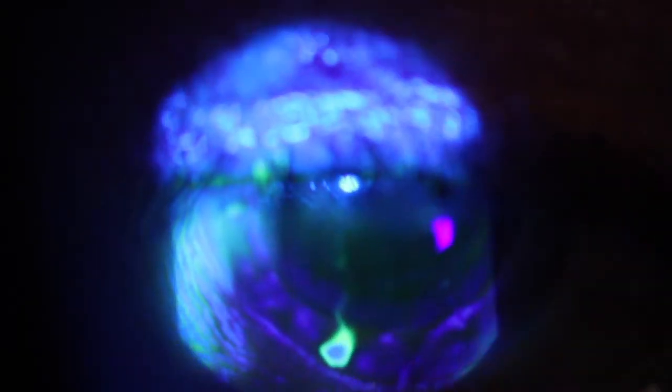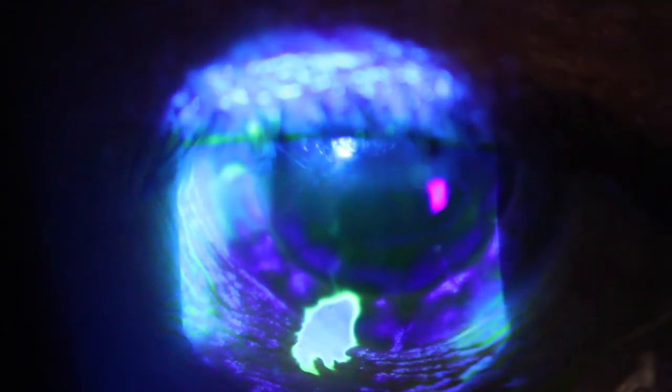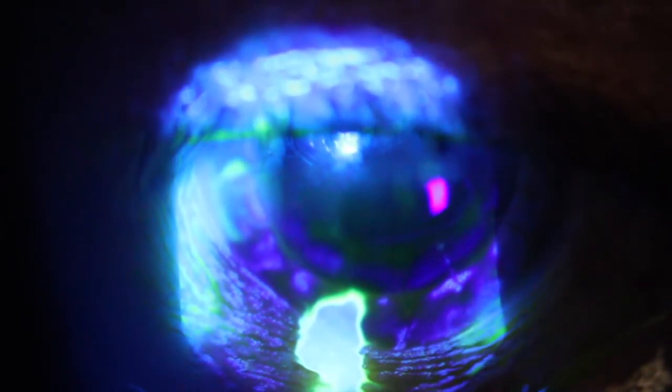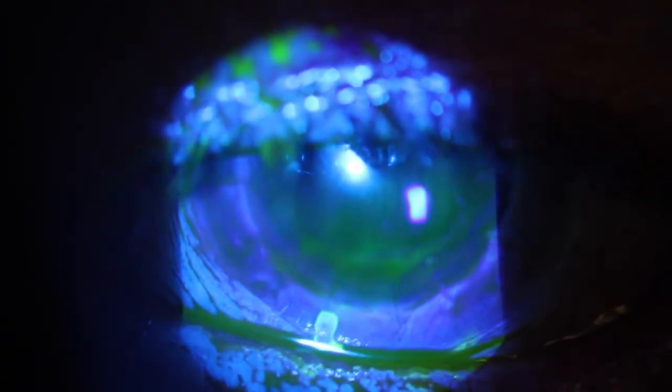People often ask me what the Seidel positive sign, or the waterfall sign, looks like — and you can see that here. This isn't in a corneal foreign body situation; it's at the edge of a corneal graft. I've instilled 2% fluorescein into the eye and you can see where that fluorescein is washing away because of the aqueous. With the cobalt blue filter on, it's very easy to see — that's a fairly rapid leak there.